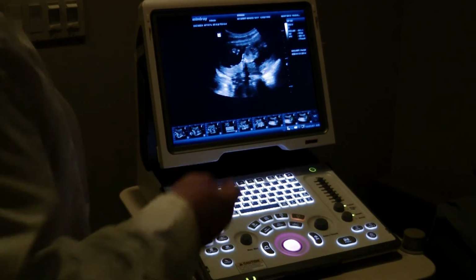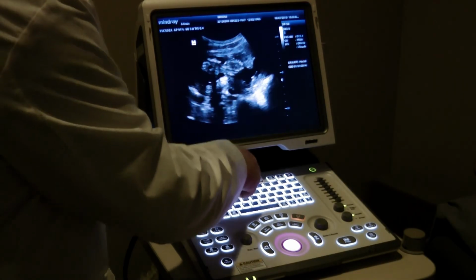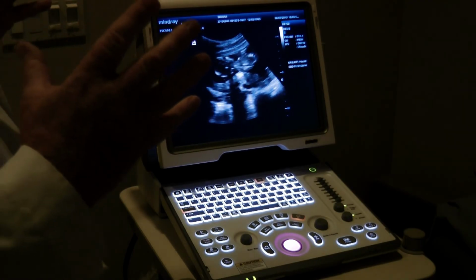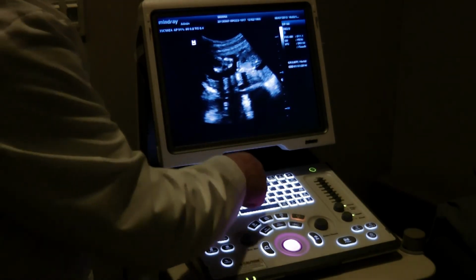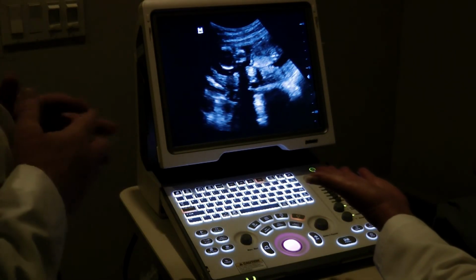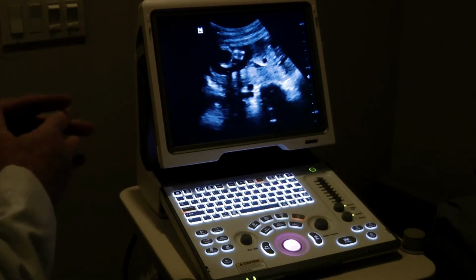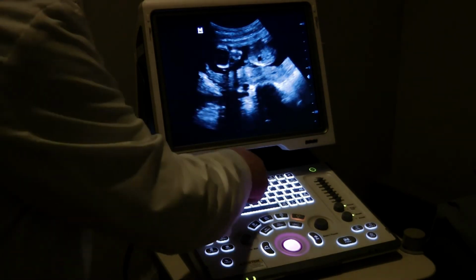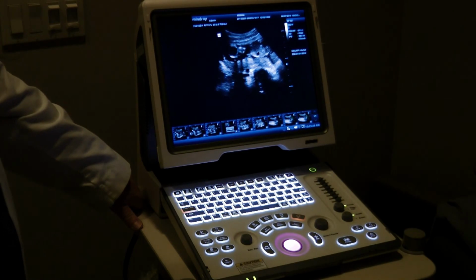You also have the option of a quick zoom, which is the eye zoom. Nice feature on this machine. Hit F4 and it automatically takes that image and zooms it up to a nice size, and it fills the whole field of view on the screen. Then we have another setting. You go to F4 again, and it fills the entire screen. Well, you don't lose any resolution. This is unbelievable, because normally, when we want to make our baby bigger, we lose resolution. It pixelates apart. Exactly. This is a great feature for those little babies too. Yes, exactly. Perfect. And then if I go F4 back again, you're right back to where you were. Okay, that is great. Oh, I like that feature.